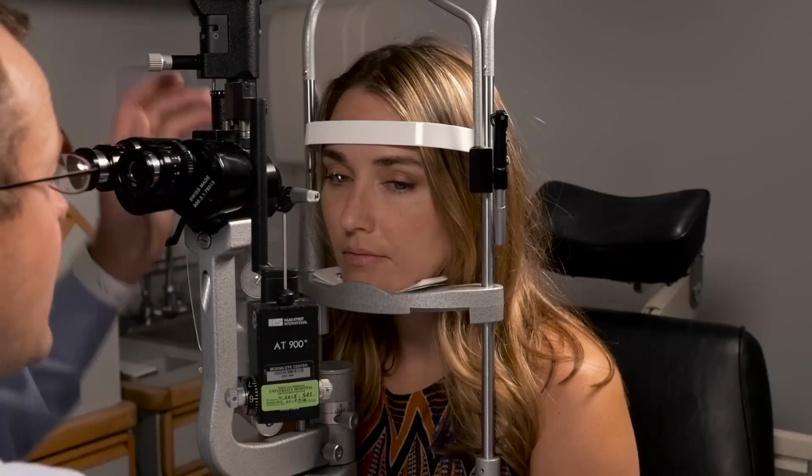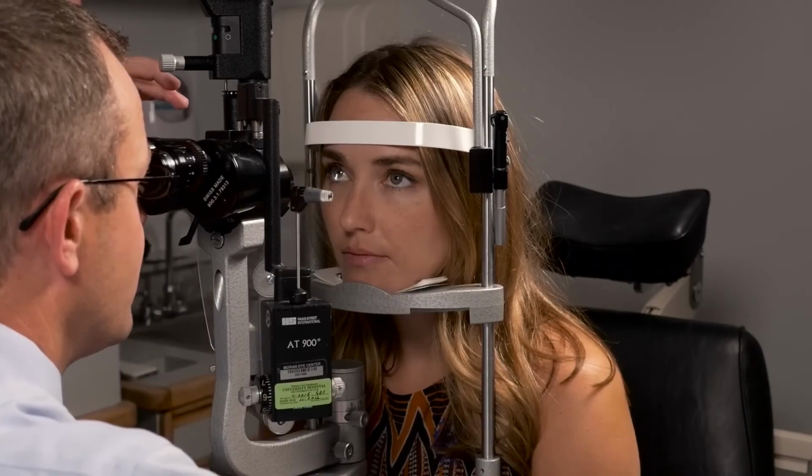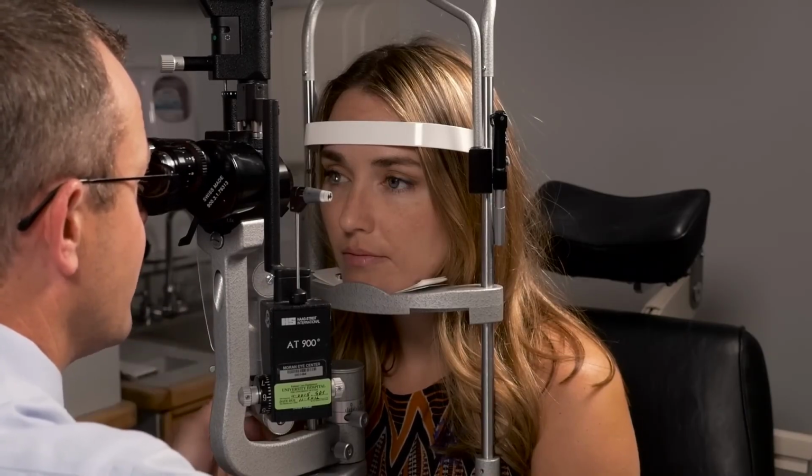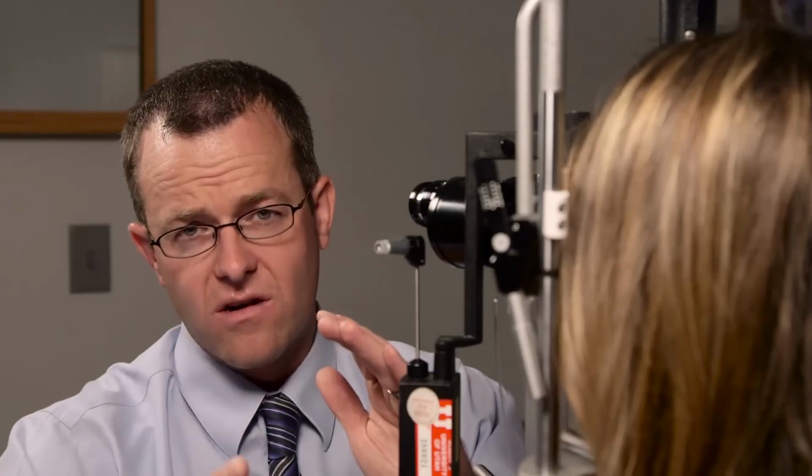And so how you look for a Shafer sign is you focus in on the lens, narrow the beam, and make sure it's nice and bright, and then you tell the patient to look up, look down, and look straight ahead. And as they're doing that, you move the joystick backward and forward until you can see the little collagen fibers. And intertwined or floating around those collagen fibers could be those pigment cells or the tobacco dust cells from a retinal tear, or inflammation or blood or something like that. And so after seeing that, then you're going to go to the posterior segment exam of the eye.